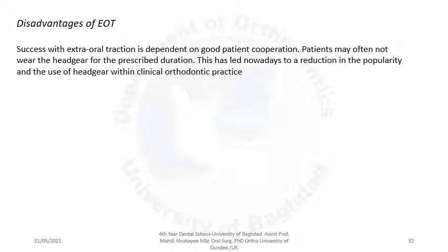Disadvantages of the extraoral traction. Success with extraoral traction is dependent on good patient cooperation. The patient may often not wear the headgear for the prescribed duration. This has led nowadays to a reduction in the popularity and the use of the headgear within clinical orthodontic practice.